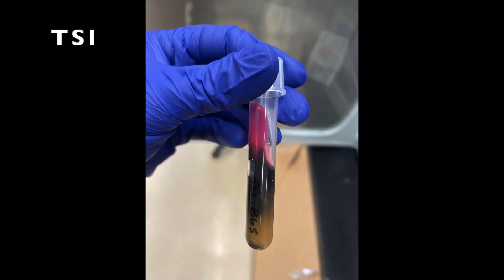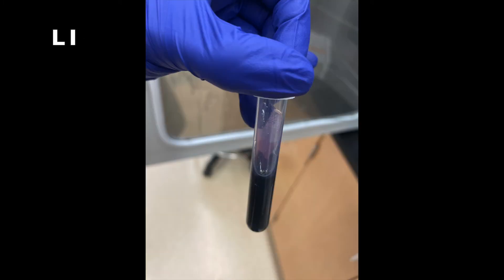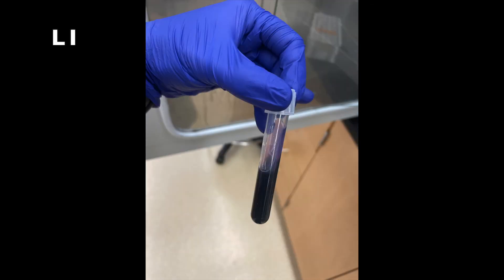Here is just an alternative view. This is an example of an inoculated LI tube. Here is an alternative view.